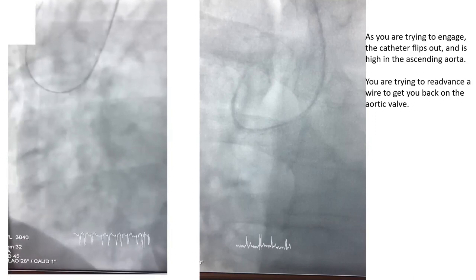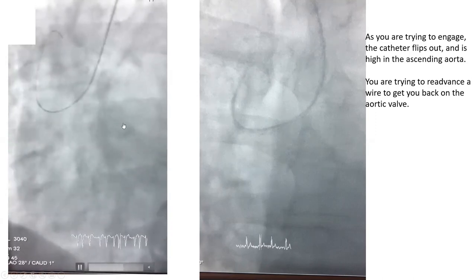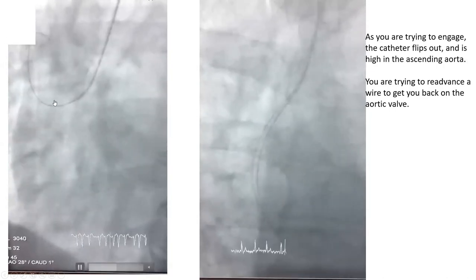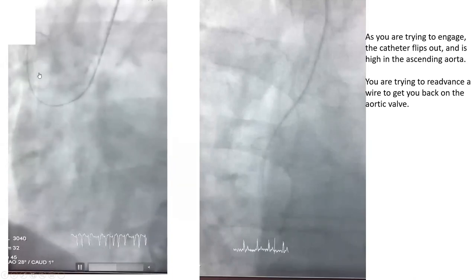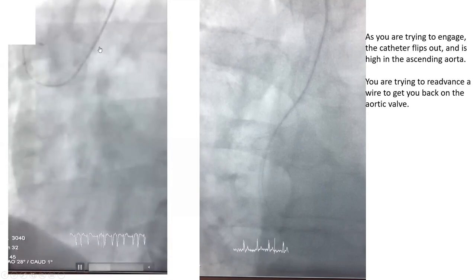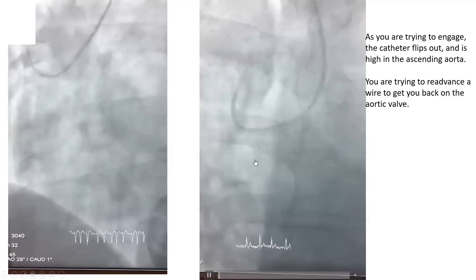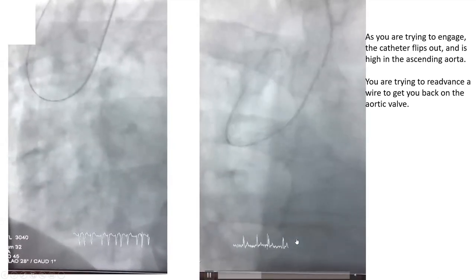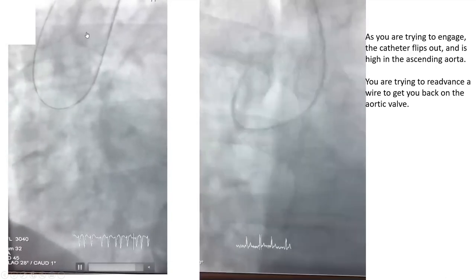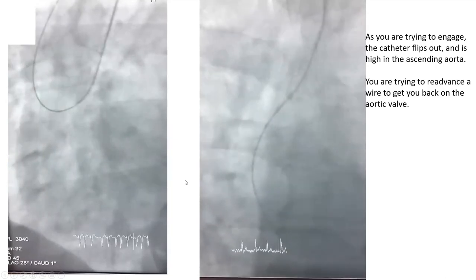The next step is not to keep pushing the wire — pull the catheter while pushing the wire. The catheter is pointing up, pointing you away from the valve. So you should actually pull the catheter while pushing the wire. The catheter was pointing us up; they pull the catheter and push the wire and the wire will fall. You shouldn't even try to advance the wire in this position — pull the catheter and push the wire. Then after the wire gets down, you advance the catheter over it.